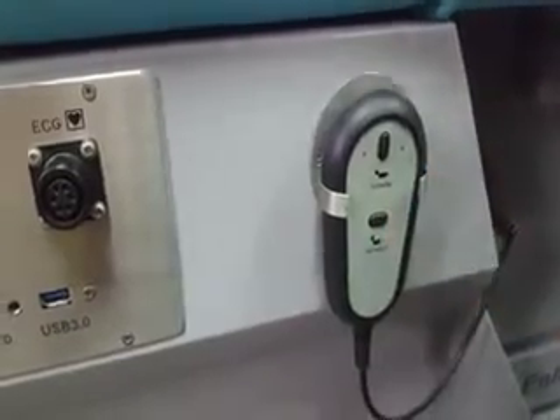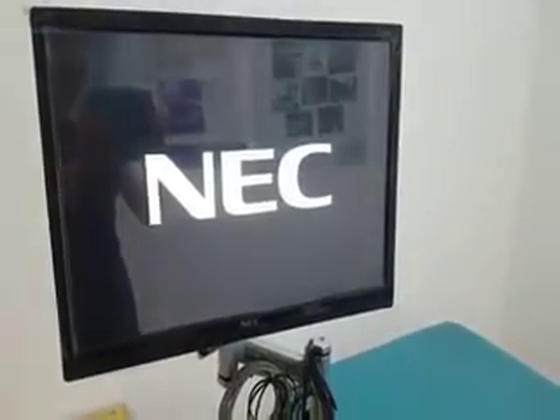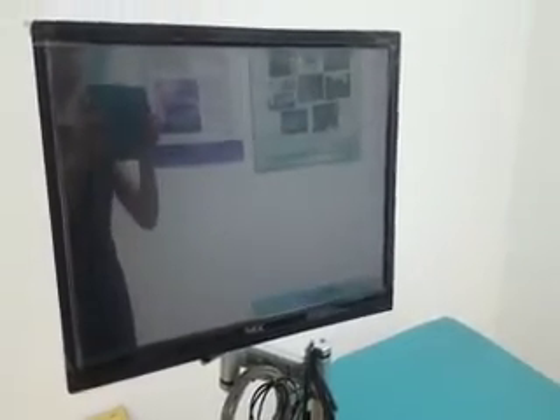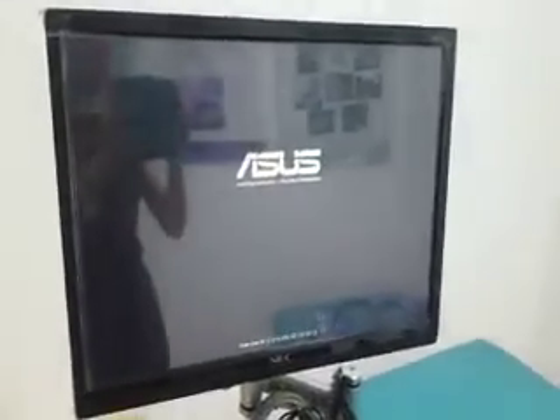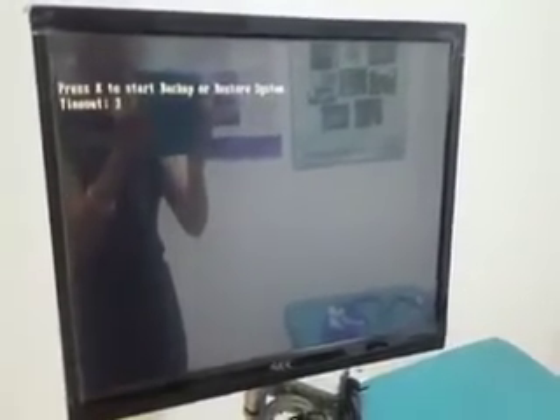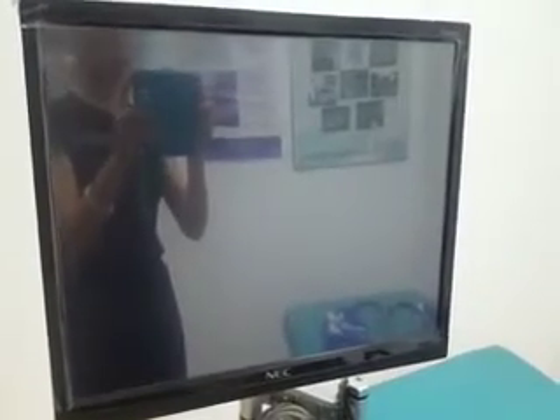Start treatment. First, turn on the main power switch and the computer switch. Let's look at the screen monitor — the welcome interface of Women Medical Instrument Company ECP MC3 is now displayed.